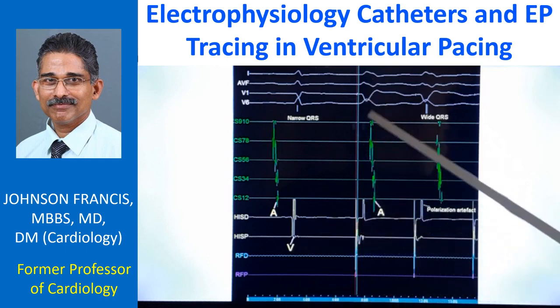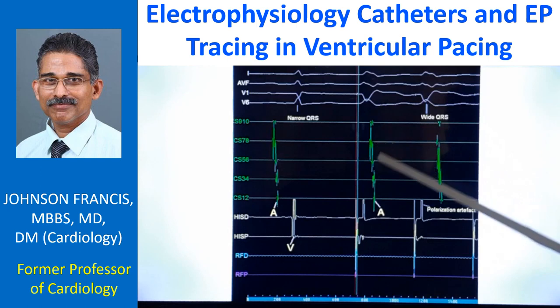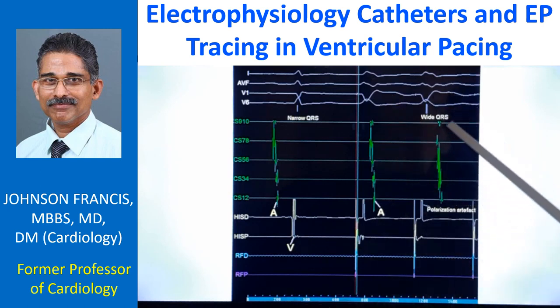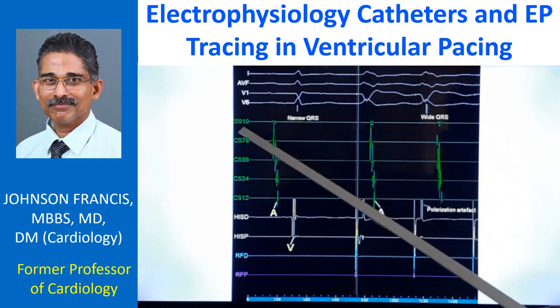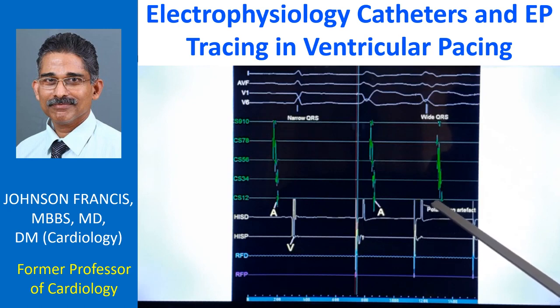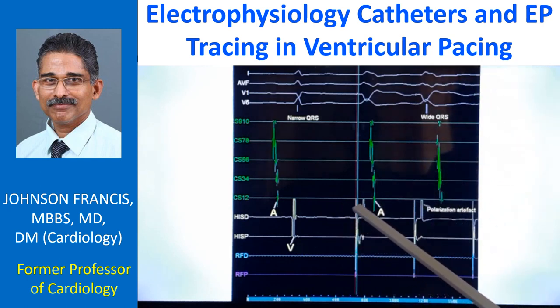And this is the atrial activation. The sequence is the same as this. So this could be a spontaneous P wave which has occurred at that time. But this is different. Here activation in the proximal coronary sinus electrode is coming earlier. So it is possible that ventricular pacing is spreading retrogradely into the left atrium from proximal to distal. That is possible in this case. And there is a good VA interval also. So this is possibly a different sequence of atrial activation. Ideally, you should have right atrial electrodes also.